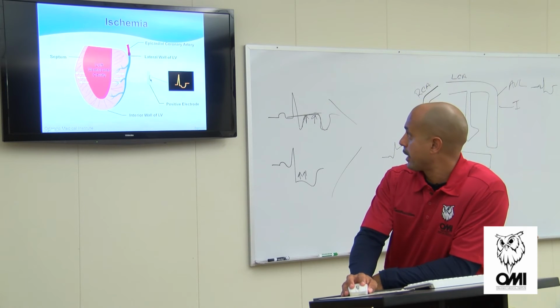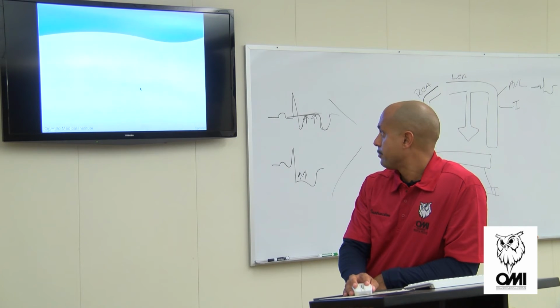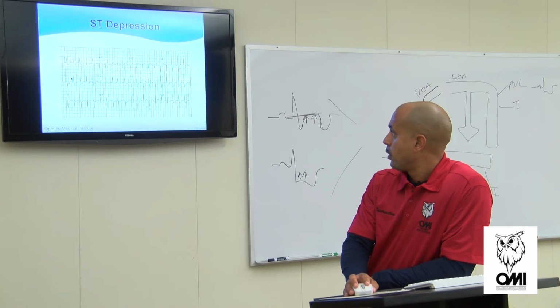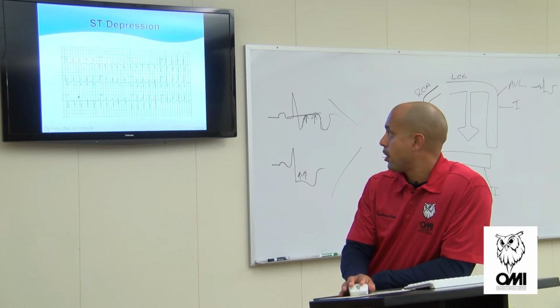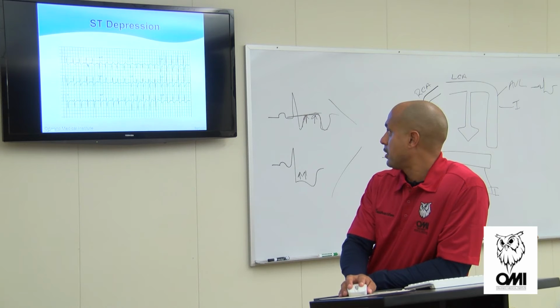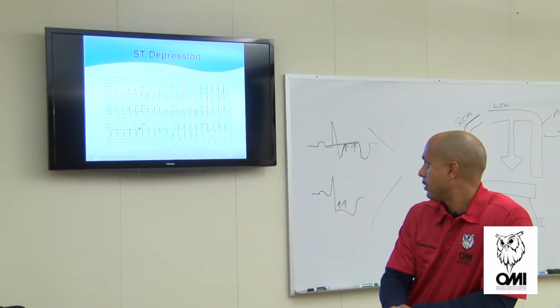So here you go. What happens? We look at the electrode right into it. You see at the endocardium where the tissue now becomes ischemic, what are we going to see? ST depression. You can see right here, you see depression. What lead is this? Lead 2. We got depression here, right? So what kind of MI is this? Inferior. So if I have depression here, how can I confirm? Actually, I could confirm it's depression. Never mind. I was going to say the way to confirm is elevation, but that's ST depression. See depression all through there.